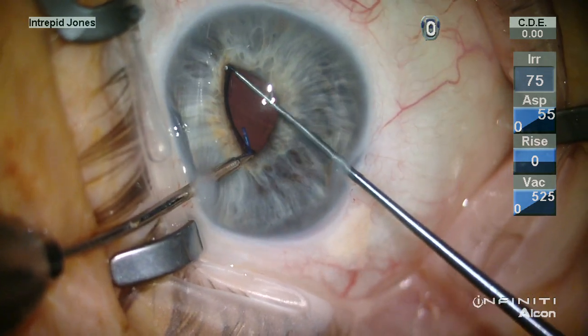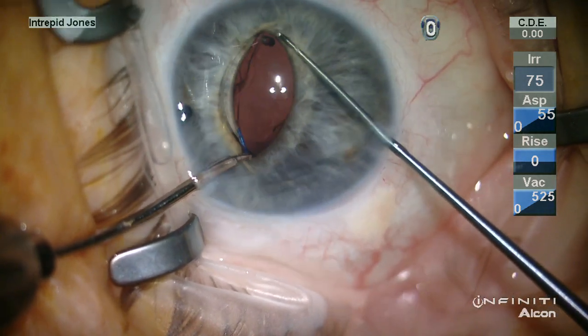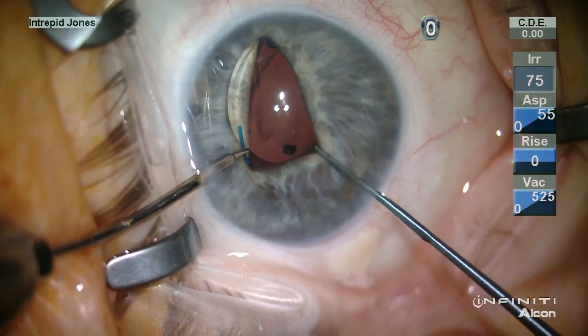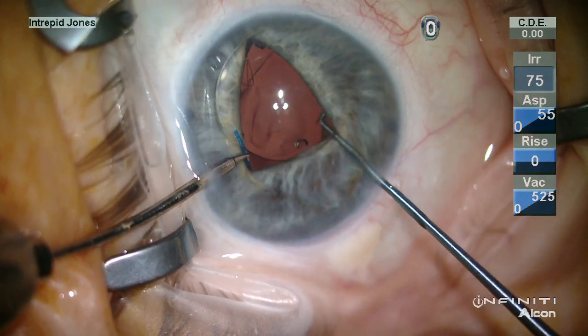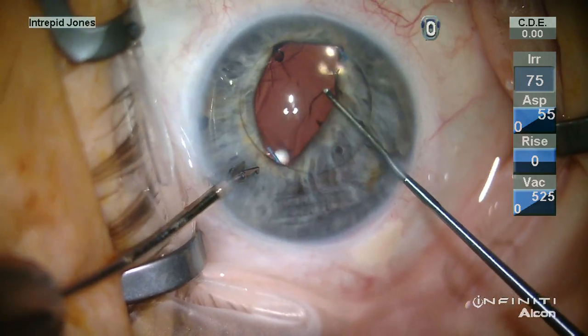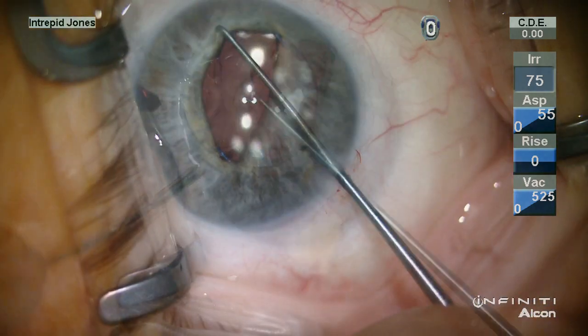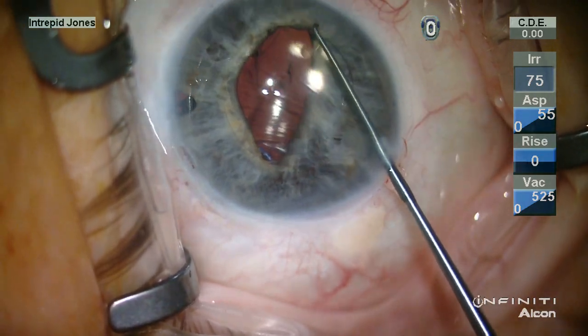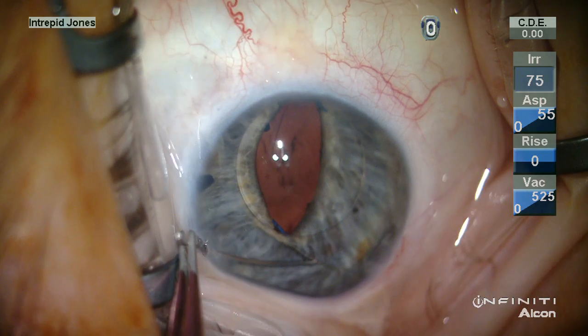Viscoelastic is used to stabilize the anterior segment and a Szynski hook elevates a haptic to the plane of the iris, where micrograspers then stabilize the lens, allowing elevation of the optic through the pupil and stabilization of the lens for suture fixation.